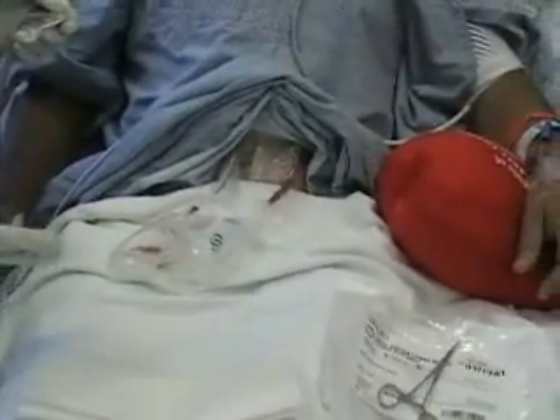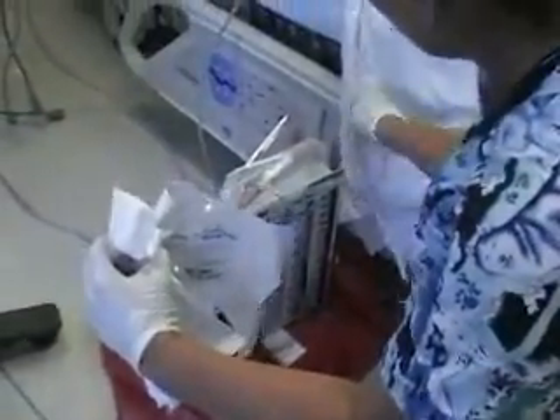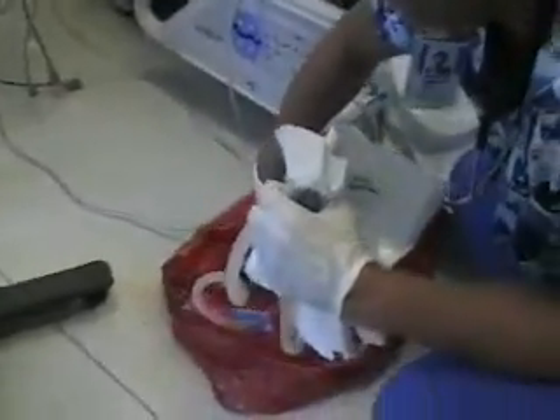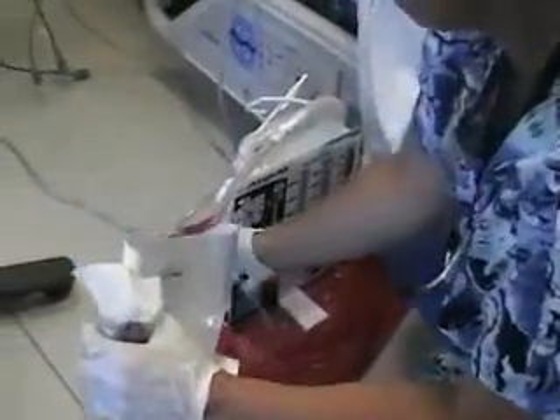Initially, when you switch them over to bulb suction, you may have a little bit more drainage within the first half hour, especially when you get your patients up. So make sure they're secure and just keep a really close eye on them every hour. Put it under output. And then we bag our chest tube in a red bag because it goes to biohazard. It's a red bag. And your chest tube here — now you can just disconnect from here and you're off the wall suction.